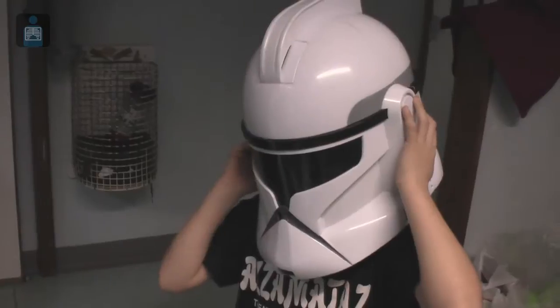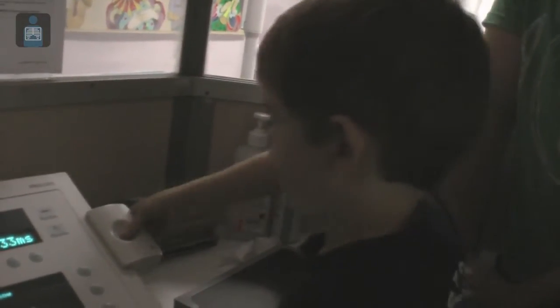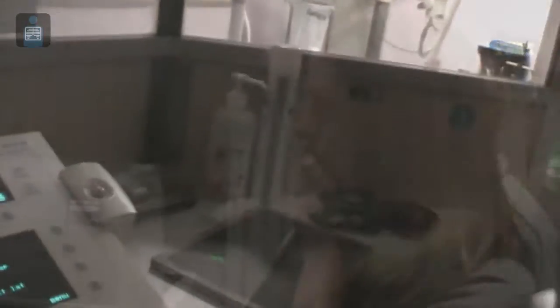I've got a bad feeling about this. Pressing the hold. That's it, well done. We need to go ahead and look on the computer.